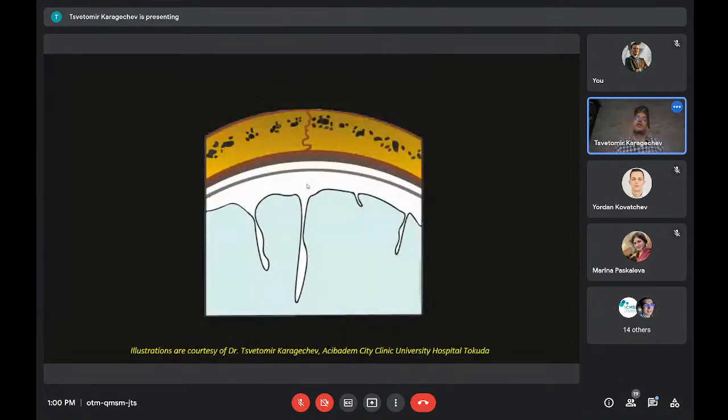So the last thing I'm going to talk about will be extra-axial lesions, extra-axial hemorrhages. And in order to understand their morphology and to be able to differentiate them from one another, we will have to talk about the anatomy of the brain meninges really quickly. So there are 3 layers: the dura mater, the arachnoid mater, and the pia mater. And this was one of my first attempts with Adobe Illustrator, but I think that I can explain it better than I have drawn it.